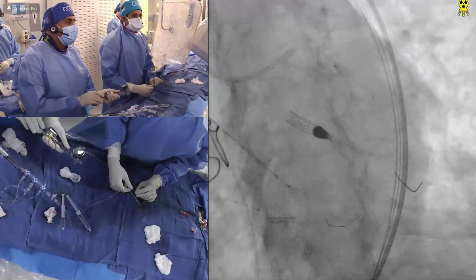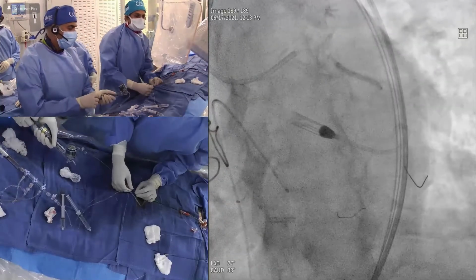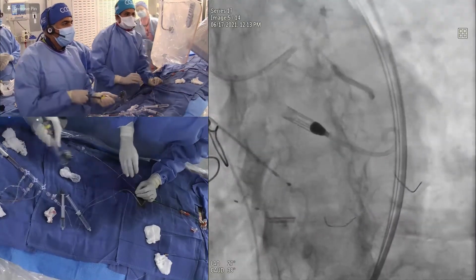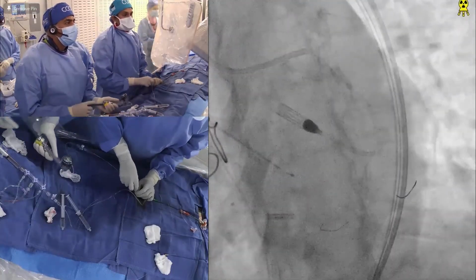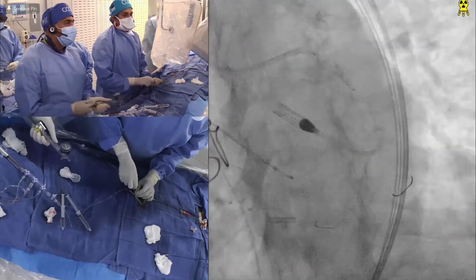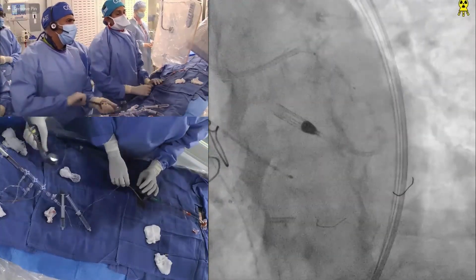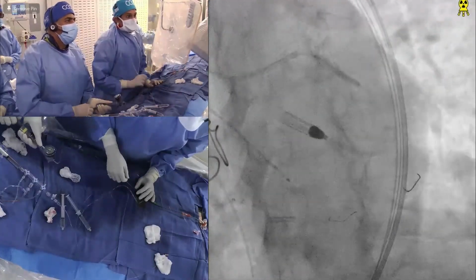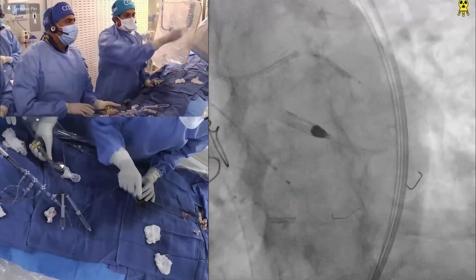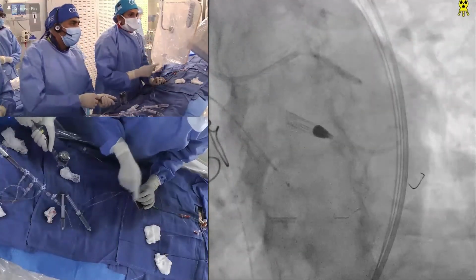Going rather than going to the second burr, and that is what we are going to do. We have written very calcific lesion algorithms 3 times already, and now getting some more experience with the shock wave, we are going to put down what is the best strategy, where the shock wave should be used, and IVL in combination or alone. And basically, yes, rather than going to the second burr, using a shock wave is absolutely a great choice.